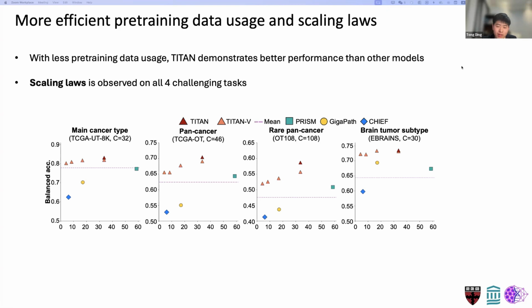We didn't spend that much time on model development. Most of the time was spent on evaluation and finding interesting applications of the model. For example, the rare disease retrieval task and creation of other benchmarks like TCGA tree classification, TCGA uniform tumor, things like that.